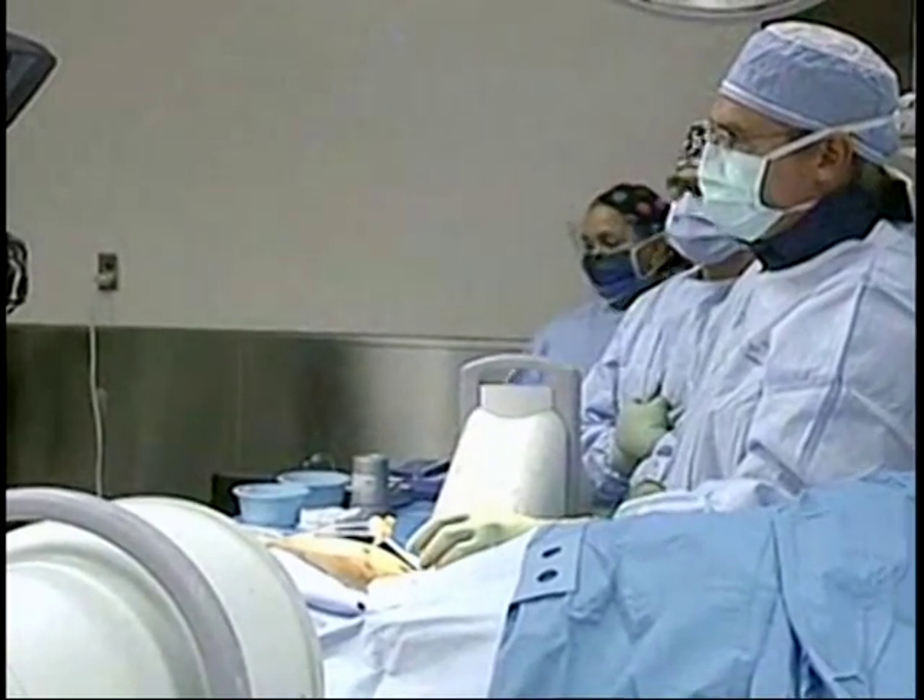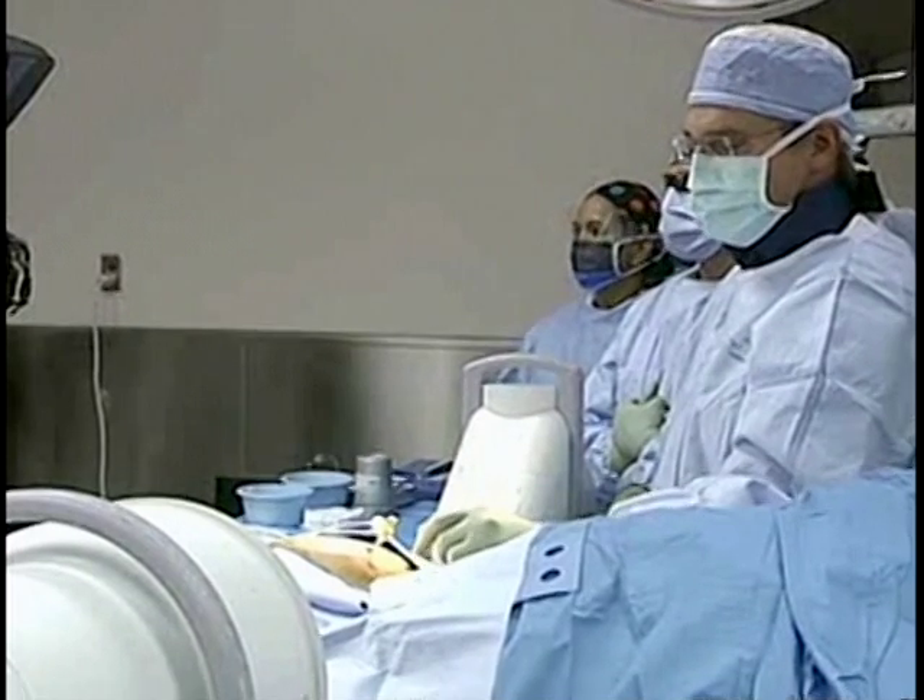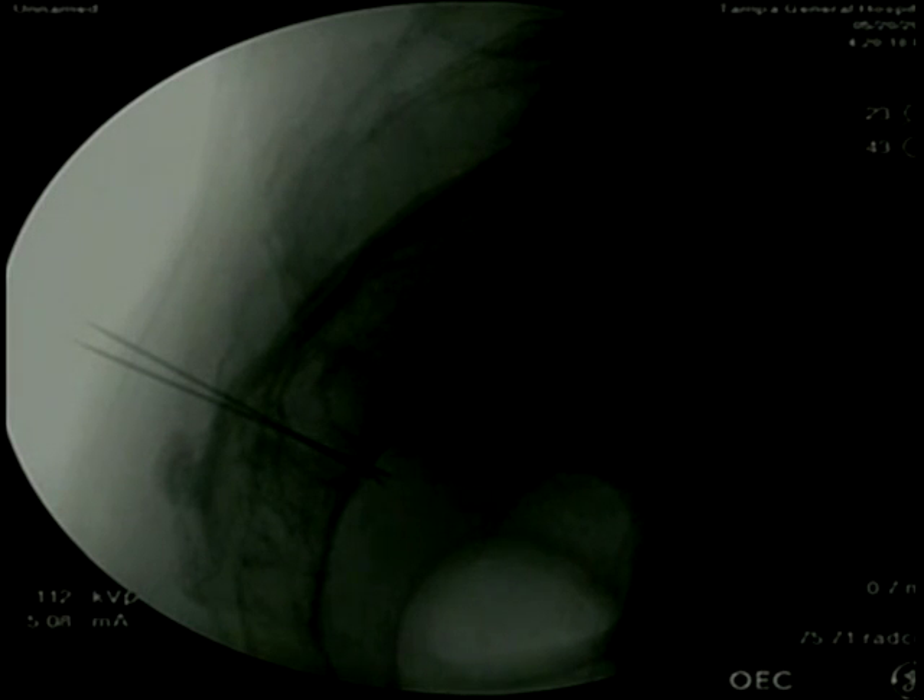I was able to find the foramen on the right side — the S3 foramen. On the X-ray image you can see two needles that are actually crisscrossing: one on the left side, the other on the right side. The tip is just beyond what we consider the ventral portion of the sacrum, right at the very margin of where the nerve enters into the pelvic space. Having placed the needle, I'm going to stimulate using the compound muscle action potential to identify if there's any response.